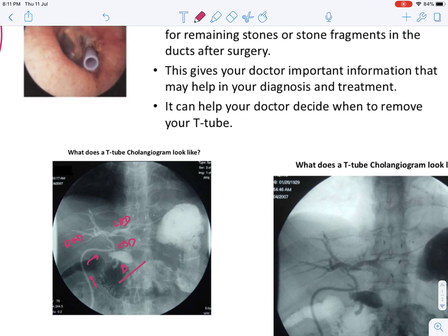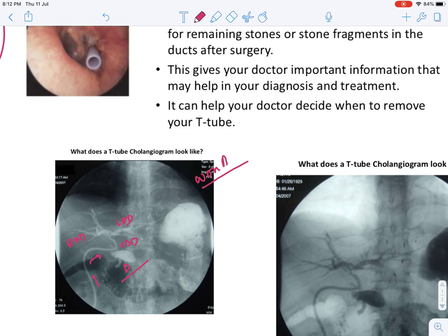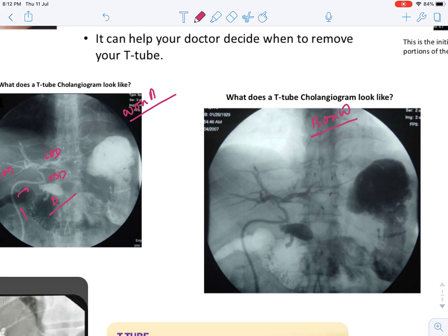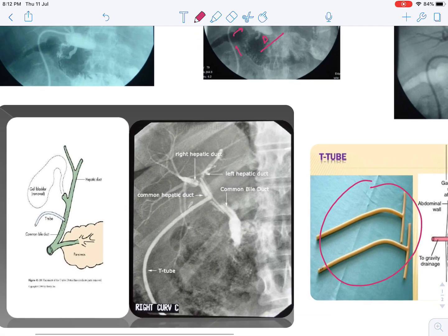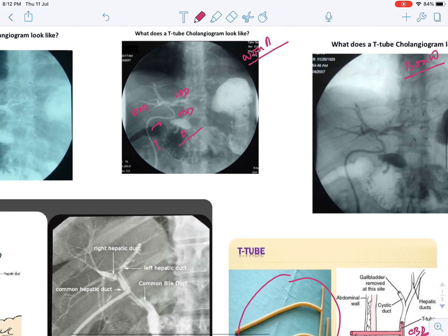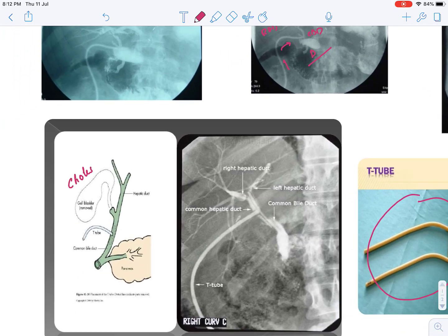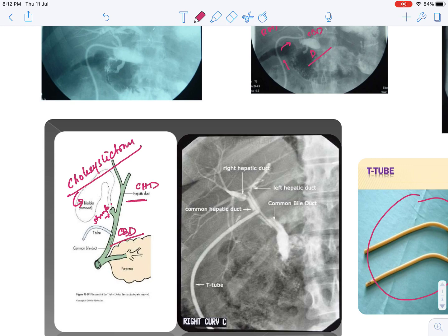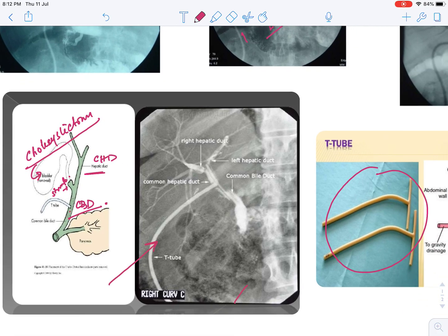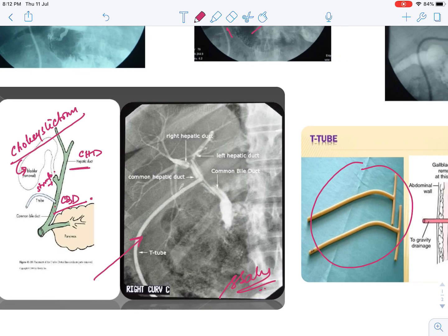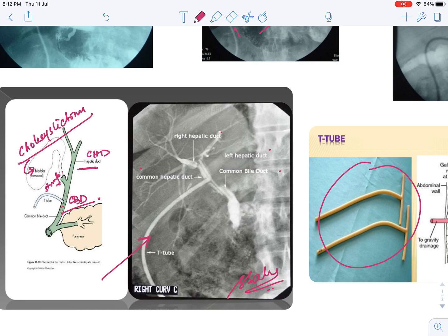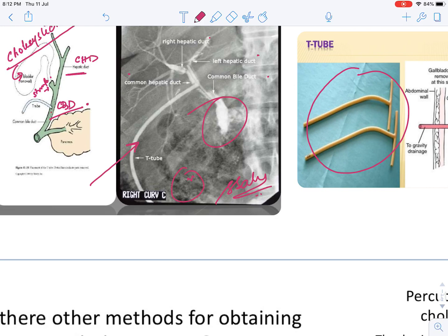This contrast is known as white on black contrast, and this is the same image in black on white contrast. Here the structures are labelled: the cholecystectomy has already been done, the gallbladder is removed and the stump is present, the common hepatic duct, the common bile duct, and the T-tube is inserted. We can see clearly the right hepatic duct, left hepatic duct, common bile duct, common hepatic duct, and the part of the duodenum where it drains. This is a normal T-tube cholangiography.